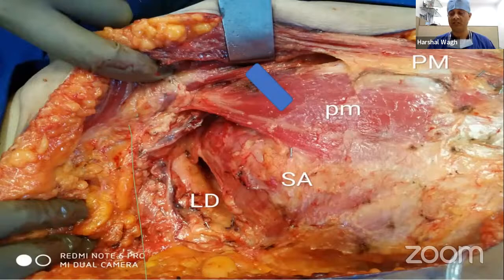Normally, when you're doing an interpectoral nerve block, you want to try and find the pectoral branch of the thoracoacromial artery, because that's a landmark which shows you're in the right plane, but sometimes you can't see it. When you put local anesthetic in the exact plane, the plane just unzippers or starts opening up, and you know you're in the right plane. Whereas if you put it intramuscular, it starts distorting the muscle. So as I go down, I'm going to see again the lateral edge of the pectoralis major and minor muscles, and then I'm going to start seeing the start of the serratus anterior muscle.